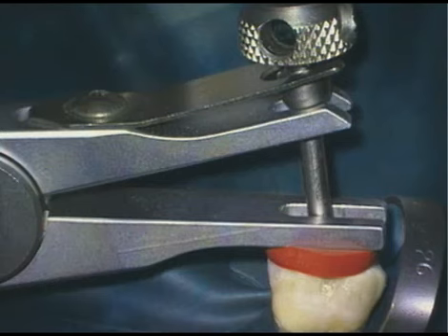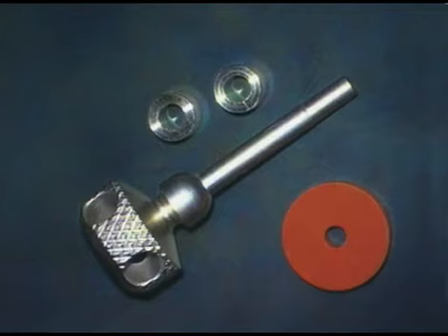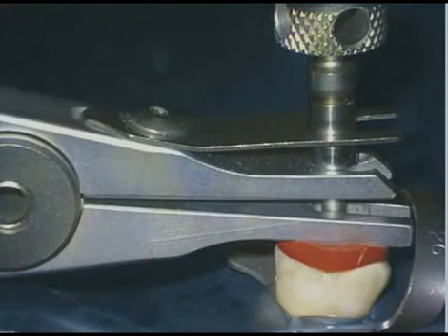Let me make a suggestion for when the arms of the extracting plier are too far apart. In these instances, we're pulling the post undesirably off axis. To better direct the removal load forces on axis, we can use thin metal spacer tubes. These spacer tubes can be inserted onto the tap to bring the arms of the extracting plier closer together and better align the removal loads.